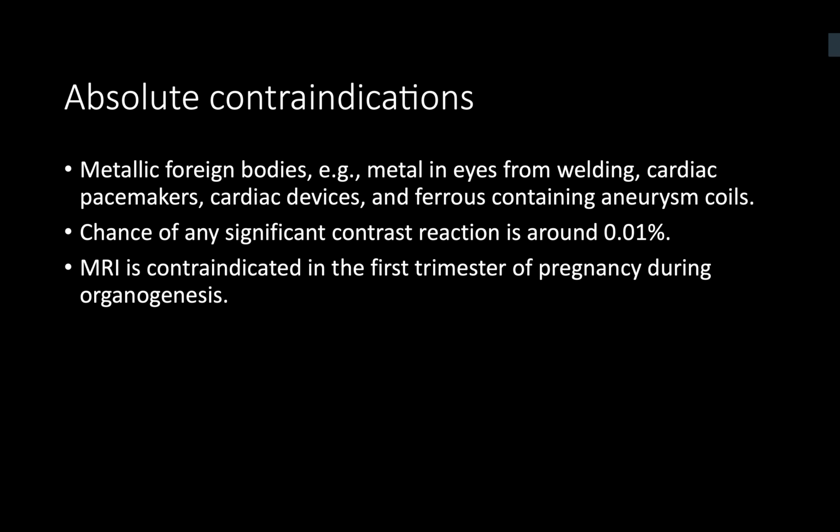What are the contraindications of MRI scan? You said a couple of them to me, but can you tell me more about contraindications? So contraindications include patients who've got ferrous materials, for example, shrapnel in the eyes. If they've got a pacemaker that's not MRI compatible, if the patient is claustrophobic, if they've got end-stage renal failure, or if they can't stay still for any reason, these will be contraindications to MRI scan.